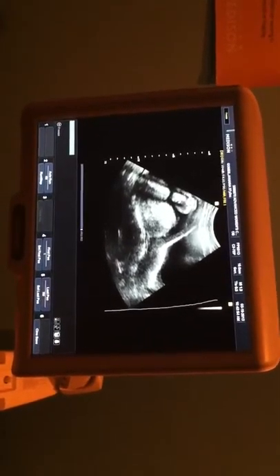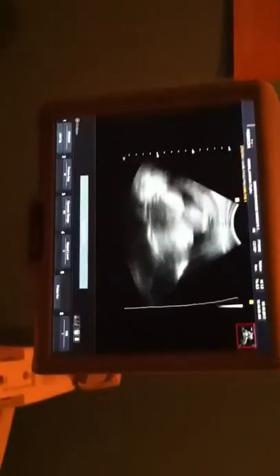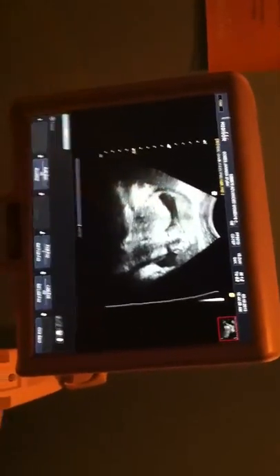This is what we call a midline shot — it's just making sure your placenta's not down in the way of the cervix. Yours is not, so that's good. There's a placenta there.